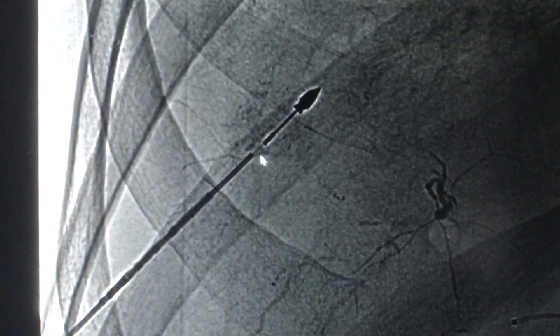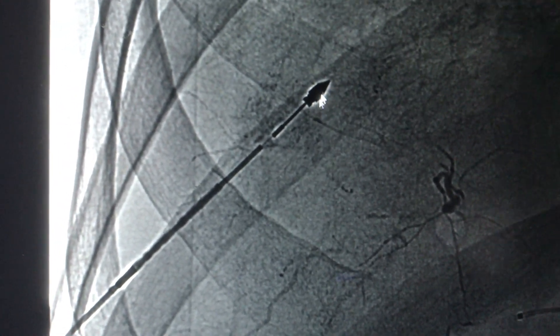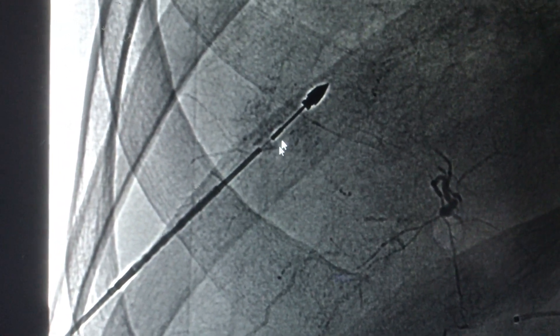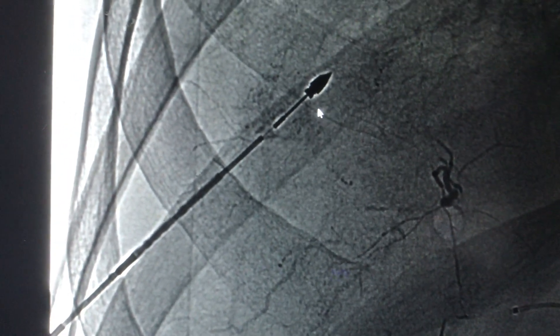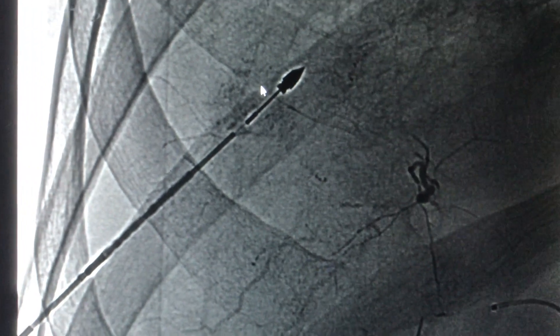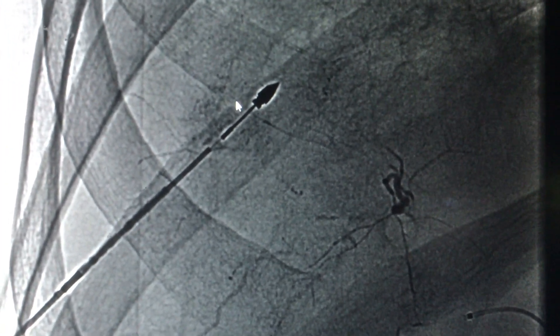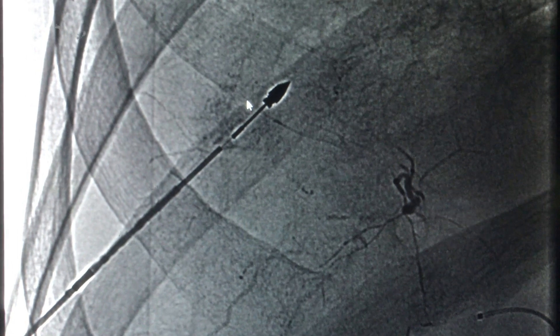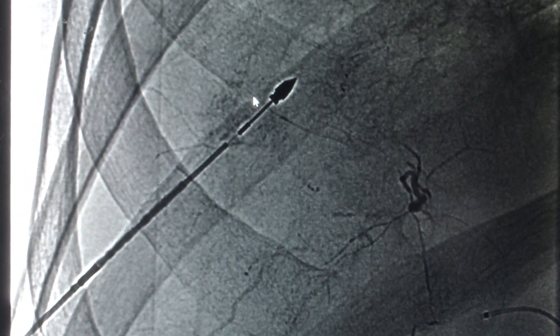This is what that probe looks like under the X-ray machine, with that pointy end showing where we enter the skin and into the tumor. Once we confirm that we are in the tumor, we burn the tumor — in this case for a total of three minutes, which gives us about a three centimeter area of burn and completely obliterates that tumor.